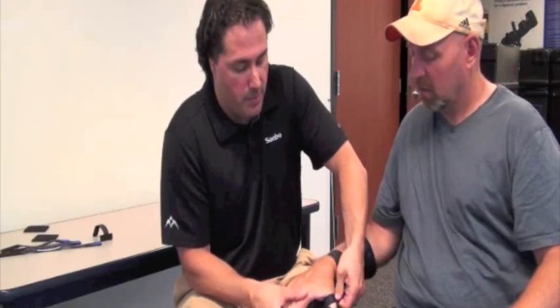Now we're done with the forearm straps. At this stage, we're going to straighten out the fingers and apply the thumb strap. I'll straighten out Tony's fingers, loosen up the thumb strap, straighten it out, and apply it right to the thumb and attach. Now the thumb is in a nice stretched position — when the thumb is stretched out, it kind of loosens up all the other fingers, which is a good strategy while donning the device.